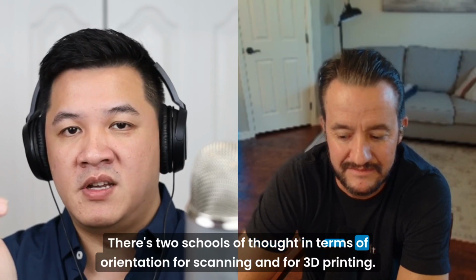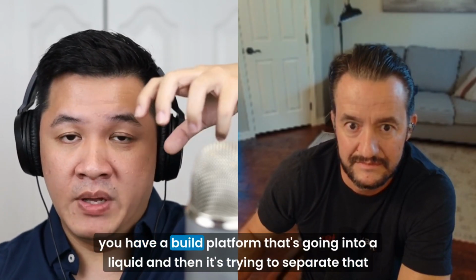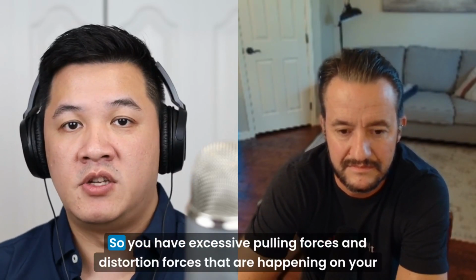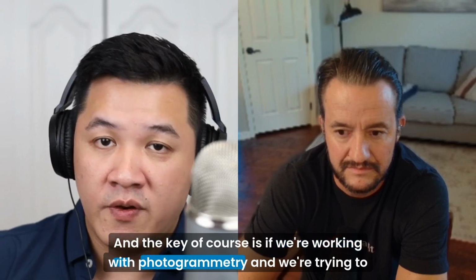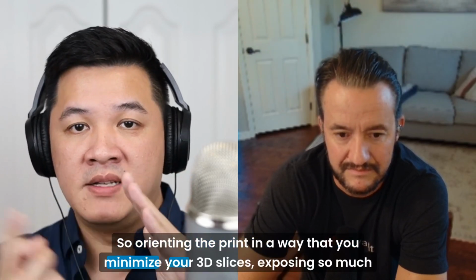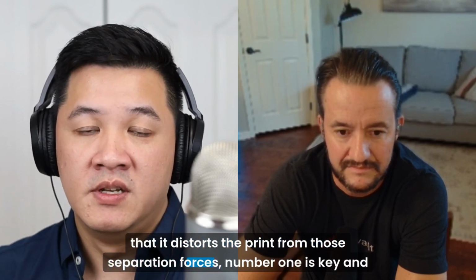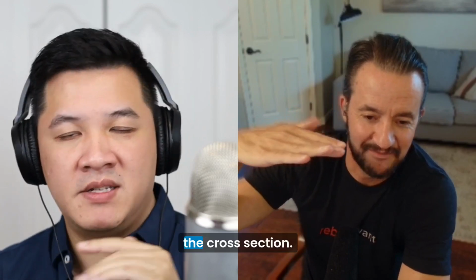There's two schools of thought in terms of orientation for scanning and for 3D printing. For those not familiar with 3D printing, the big thing is when you're printing anything, you have a build platform that's going into a liquid, and then it's trying to separate that build from the bottom of the tray. So you have excessive pulling forces and distortion forces that are happening on your pattern. And the key, of course, is if we're working with photogrammetry and we're trying to mitigate cross-arch distortion, we want to mitigate that as well in the actual product that we're producing. So orienting the print in a way that you minimize your 3D slices, exposing so much that it distorts the print from those separation forces, number one, is key and critical. So I always recommend the 35 to 45-degree angle to minimize the cross section.